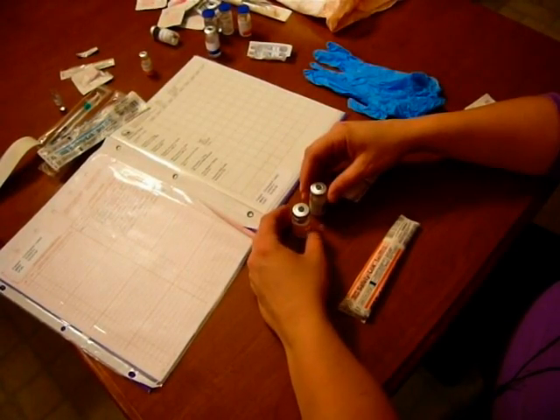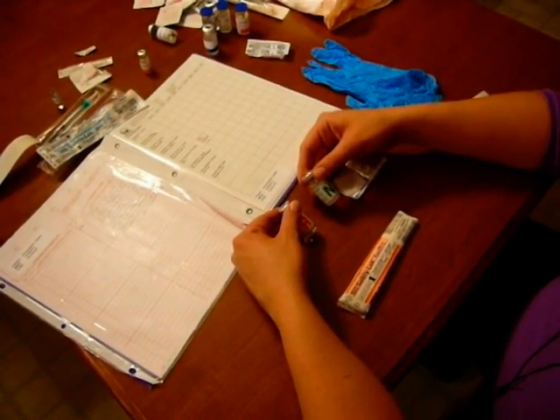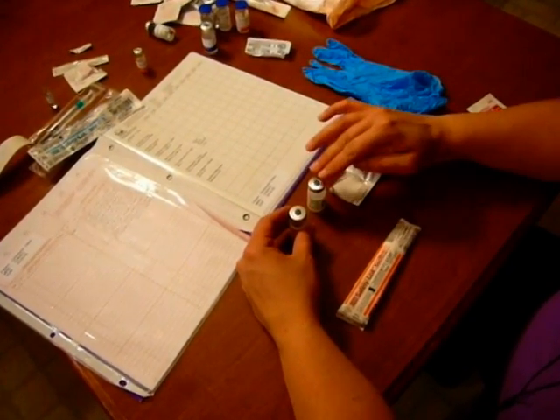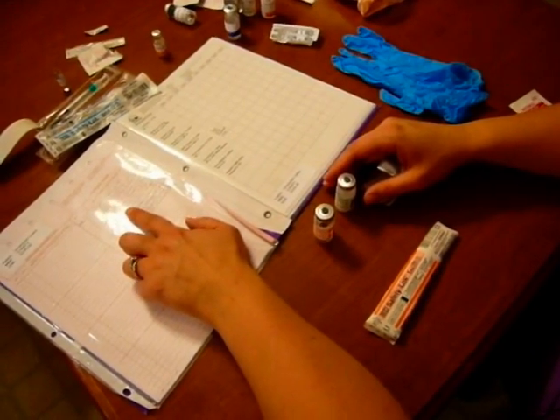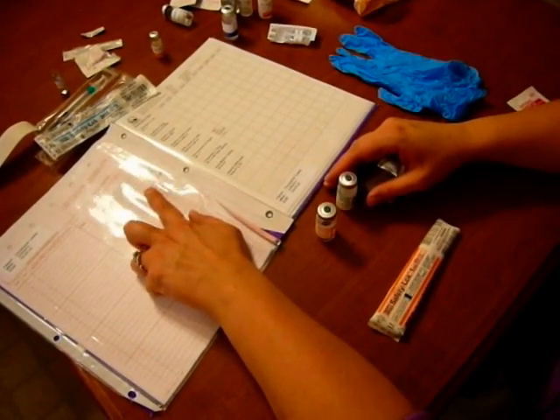Now we're going to mix insulins. What we're going to do is mix regular insulin and NPH insulin for our patient. When we're doing this, we have to make sure that we do the order of draw correctly. First, I'm going to check my order. I have an order for regular insulin 6 units and NPH insulin 18 units every AM.